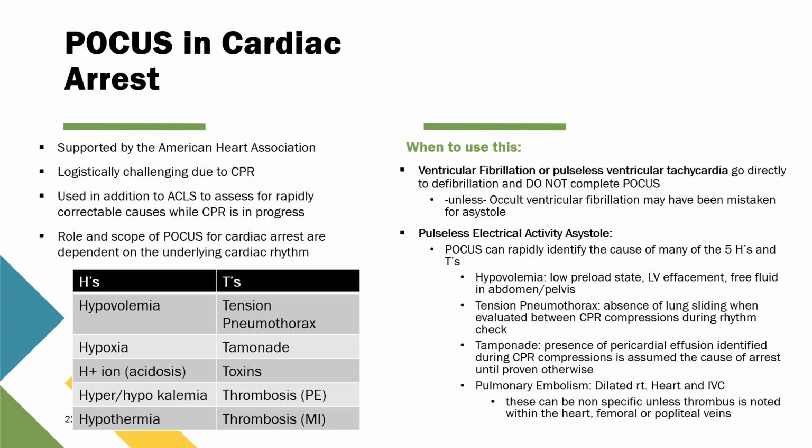So how do you utilize ultrasound in cardiac arrest? This can be really challenging because the purpose of utilizing ultrasound in cardiac arrest is to add information without disrupting the cardiopulmonary resuscitation at all.